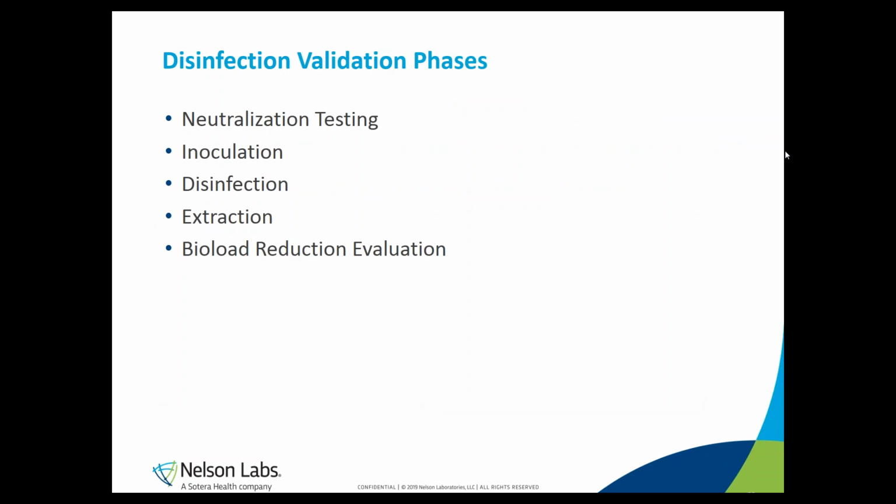So Melissa, do I understand it correctly that the disinfection validation is very similar to a cleaning validation? Yes, Stefanie, that is correct. But an important part is the neutralization study. So prior to the actual disinfection validation, a neutralization study is performed to demonstrate the absence of growth-inhibiting disinfectant in the extraction fluid and on the membrane, causing inhibition and false negative results. This is not what we want.